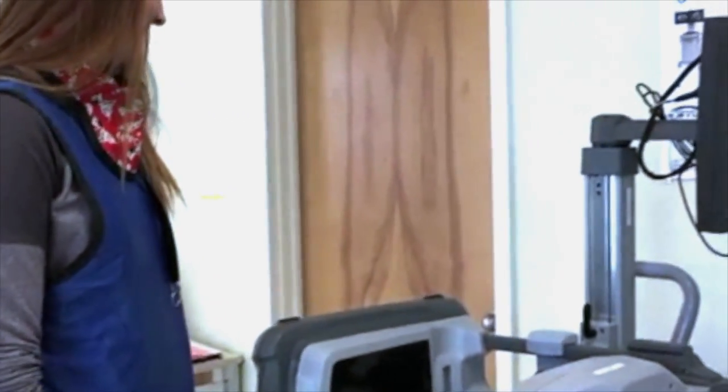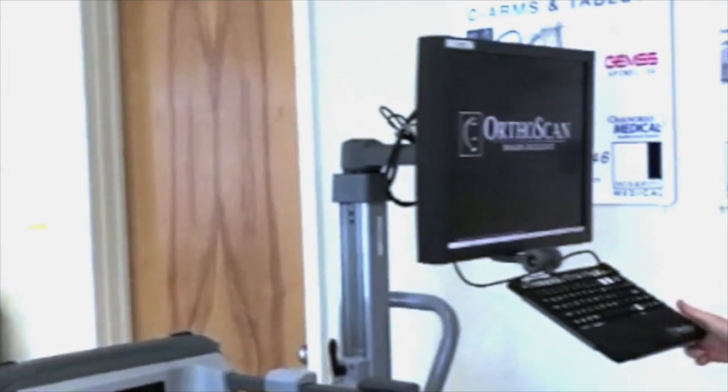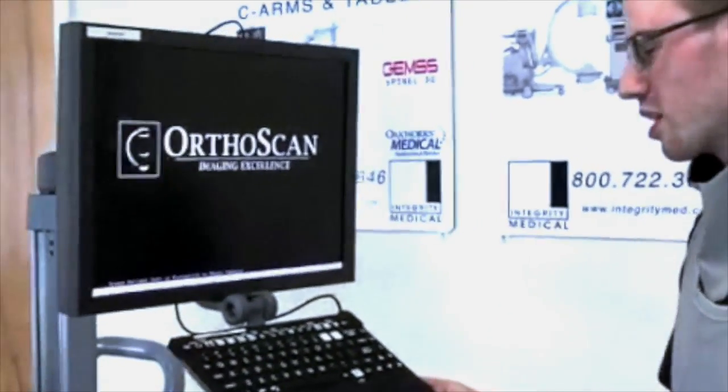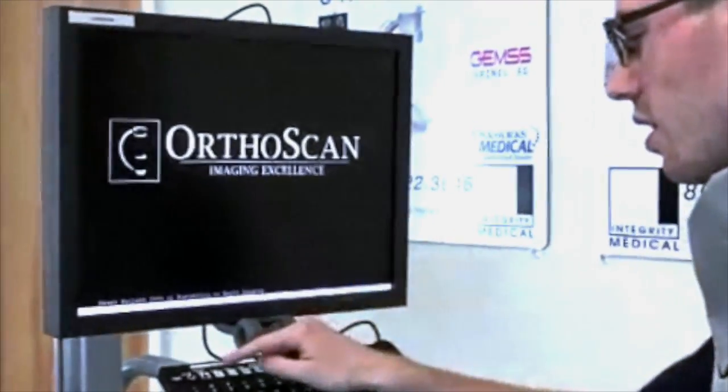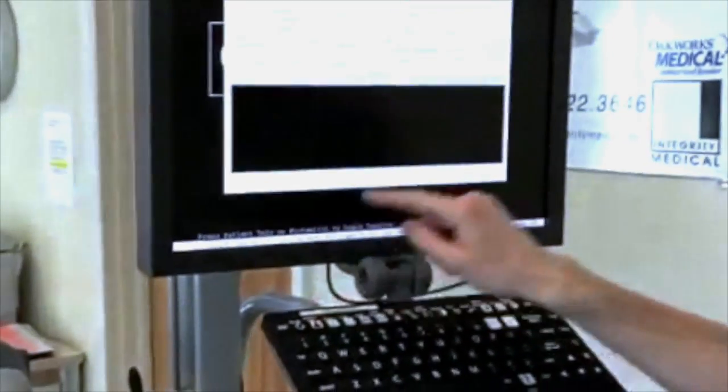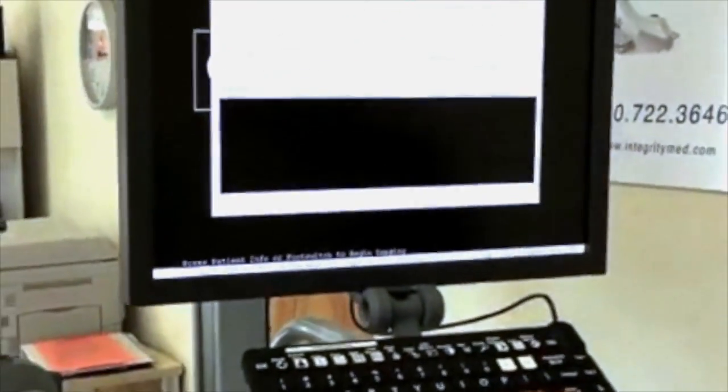The first thing we're going to do is show you how to create a patient. Once the machine boots up, you're going to click this button right here, patient info. Right here we're just going to put Jane Doe.